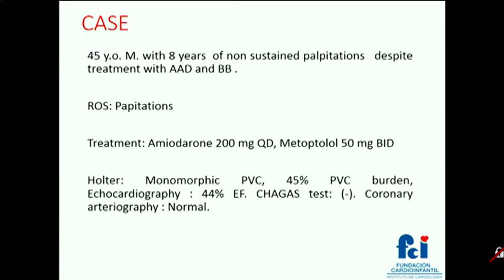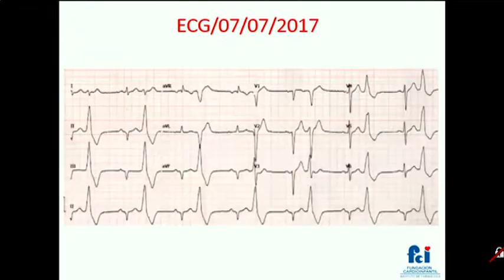We did coronary arteriography, which resulted negative. Chagas test was also negative. On this slide, you can see the morphology of the extrasystole. The patient was bigeminal.